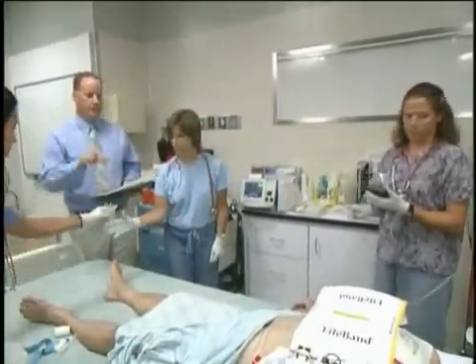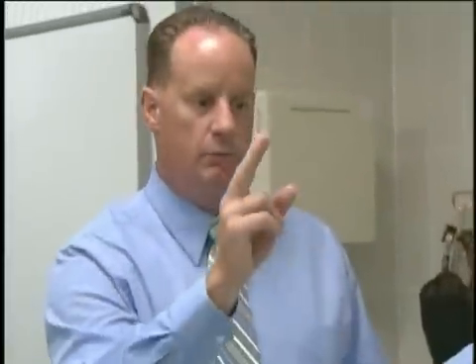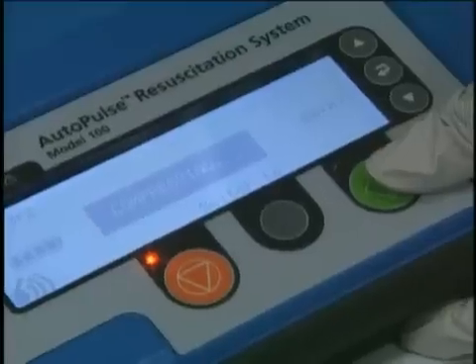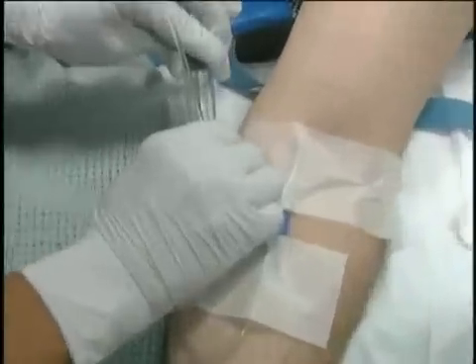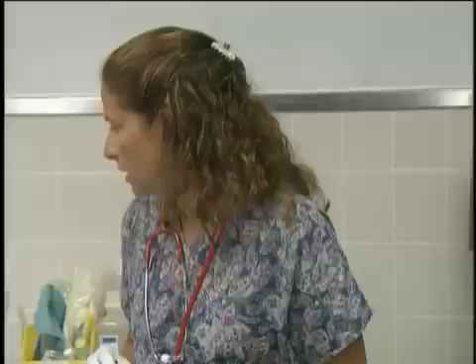Let's circulate that for a few minutes and let's pause the auto pulse and see what the underlying rhythm is. Okay, that looks like asystole. Let's restart the auto pulse, please. Let's get another milligram of epinephrine ready, please. And we'll have some atropine — one milligram of atropine and one milligram of epinephrine. Let's circulate that in. We have capnography, please. We have a pulse with the auto pulse — strong pulse. Let's pause the auto pulse and see what the underlying rhythm is. Okay, looks like we're back in VFib. Let's re-engage the auto pulse and get ready to defibrillate at 200 joules.